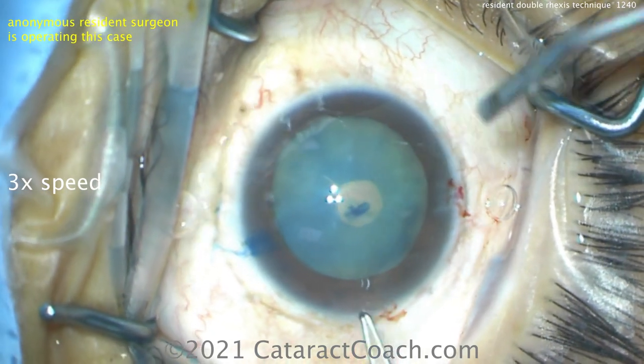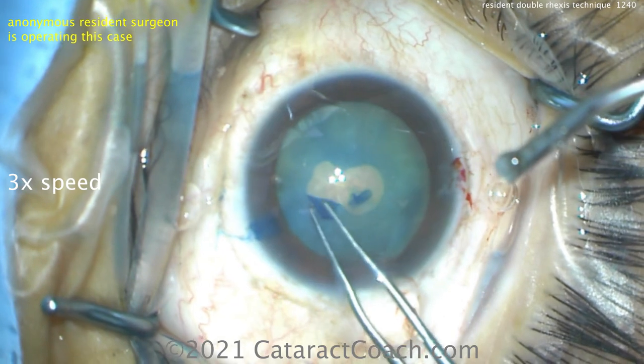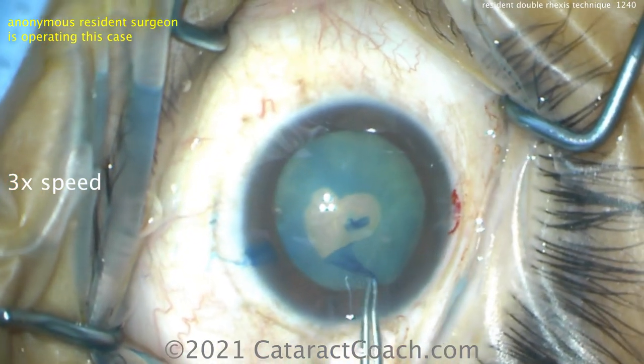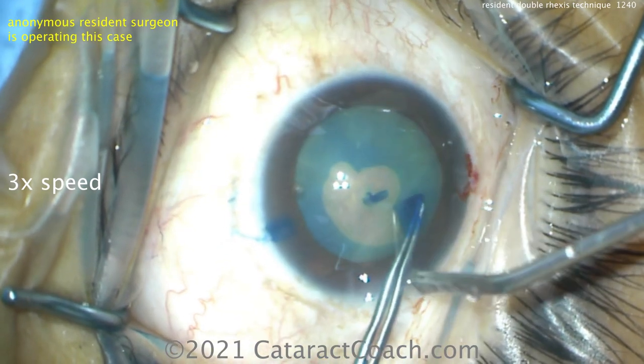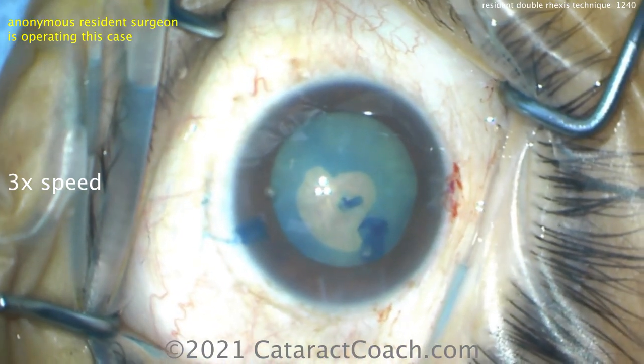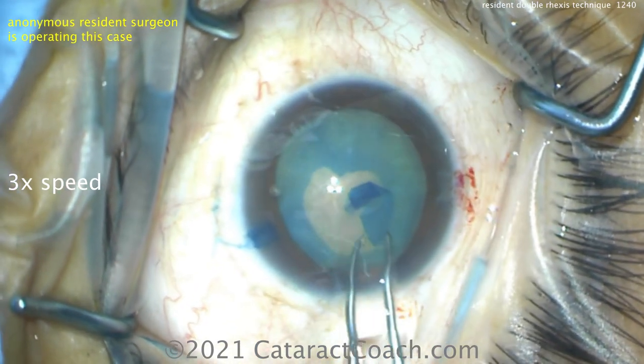So nick there with the forceps, and now the resident can create a nice five millimeter rexus. She is doing a great job here. This resident is one that I admire very much because she worked so incredibly hard to improve her skills. This is probably about case 50 or 40 in her training.